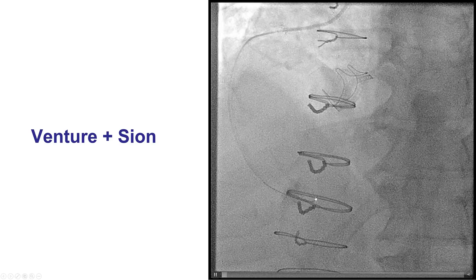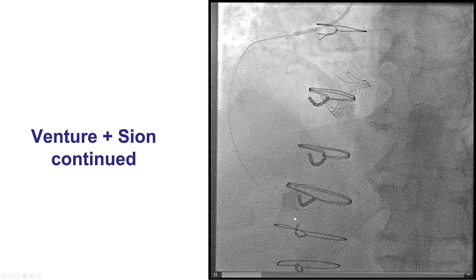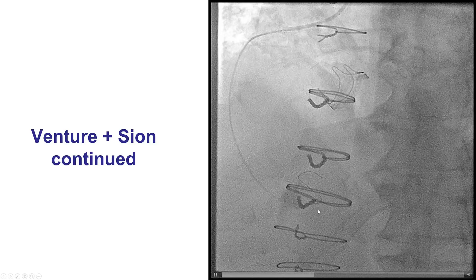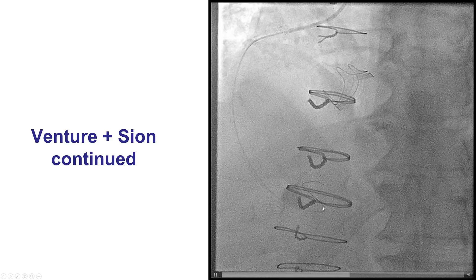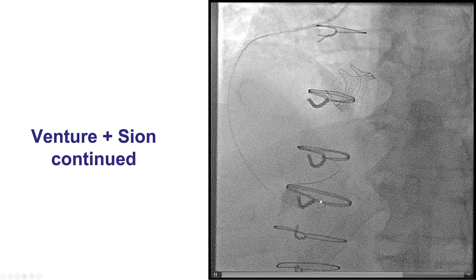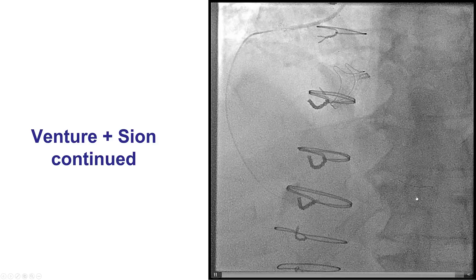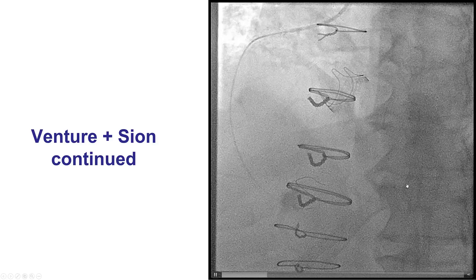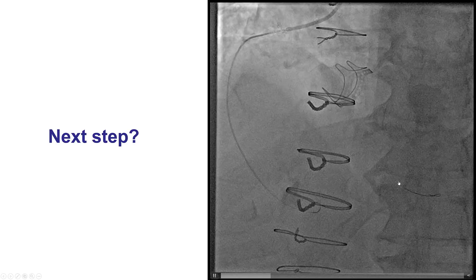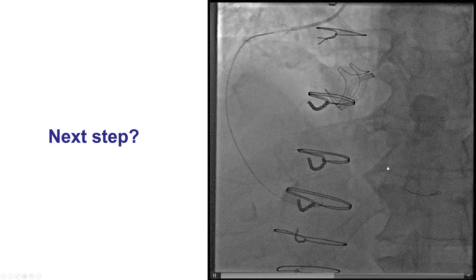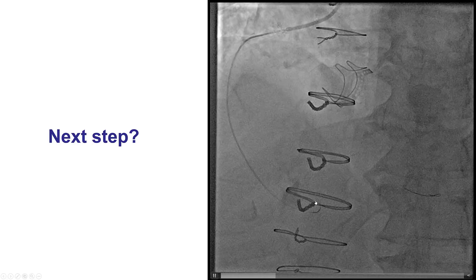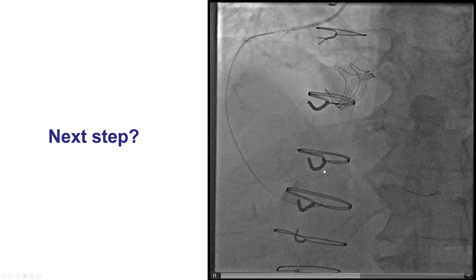The wire kept entering small branches. To overcome this, we advanced the Venture — bent up to 90 degrees — all the way into the touchdown of the SVG to the PDA, gaining very strong support that allowed us to advance the Sion guidewire all the way to the posterolateral. Retrospectively, we should have changed to a more supportive wire such as an Ironman, Grand Slam, or Wiggle wire. We left the Sion wire, which was a 300 cm wire — important for very distal lesions through bypass grafts, as shorter wires may not allow equipment exchanges.